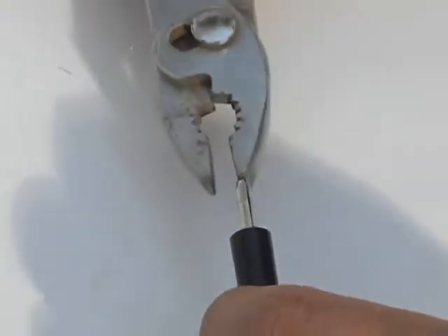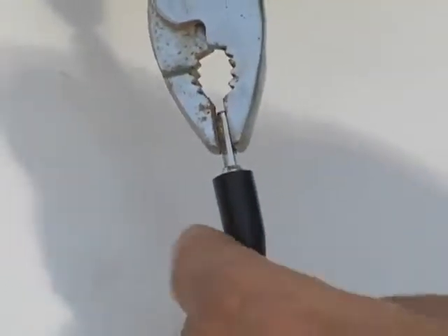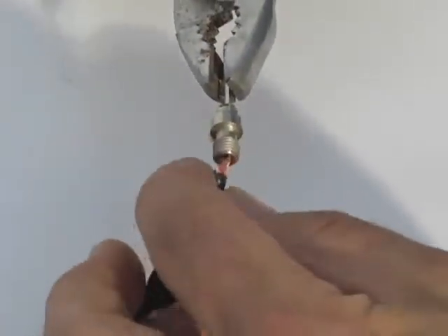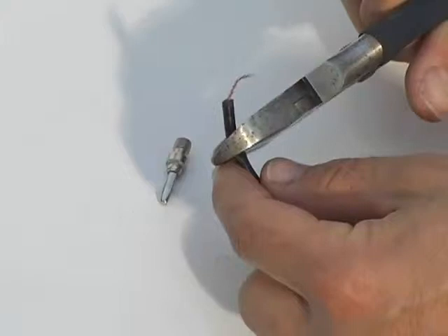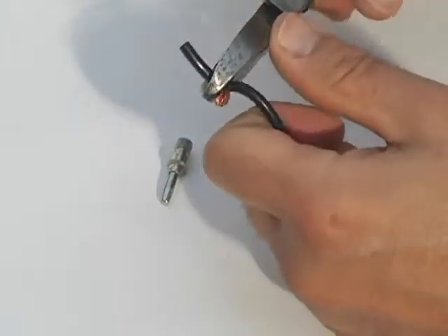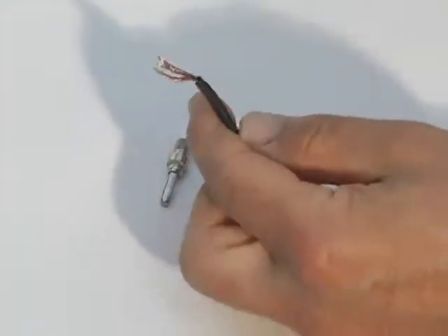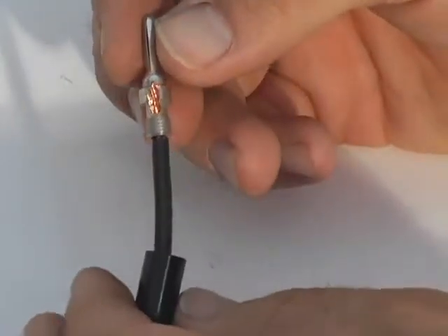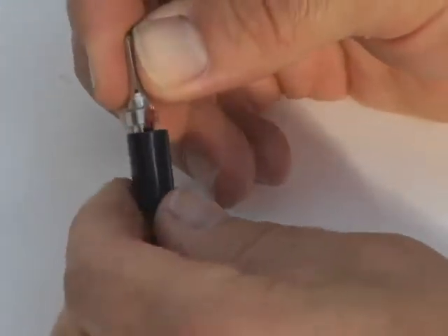To repair a cable, hold the tip with pliers and unscrew the black plastic cap. Slide the cap back down the cable. Cut back the cable. Strip off and expose about 1/2 inch of wire. Rethread the wire into the hole in the metal tip. Screw on the cap and tighten.